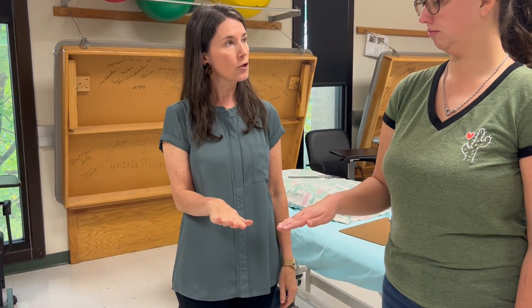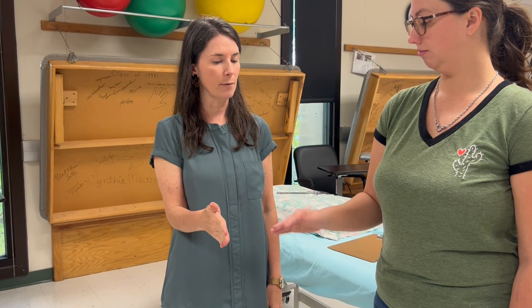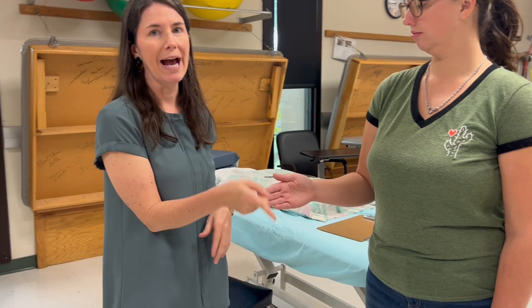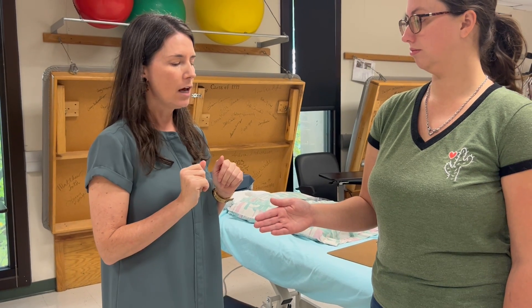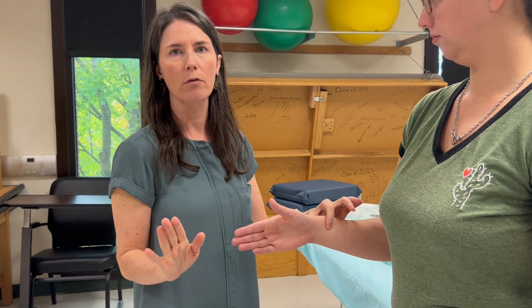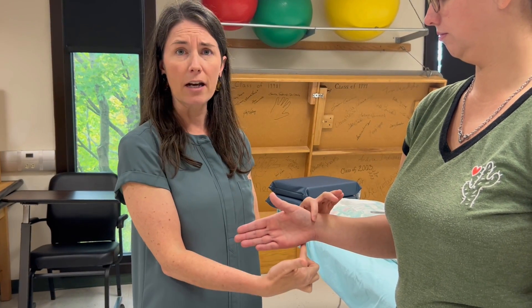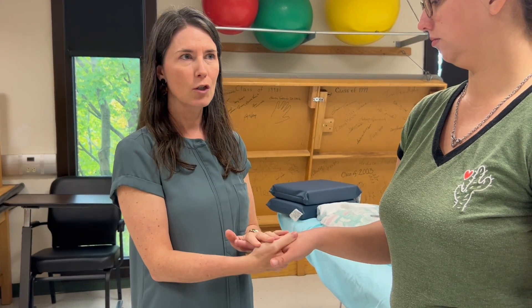You could say to your patient, 'Turn your palm all the way up' — just knowing that only the first half is what you're really looking for — or you could say 'turn so your thumb is facing up to the ceiling.' That's her grade three. Now I need to try to push her back to where she started. We don't shake hands to apply resistance because we're crossing so many joints, and the number one rule of MMT is not to cross the next joint. If she has weakness at her wrist or grip muscles, that could impede the grade I give her for forearm supination.